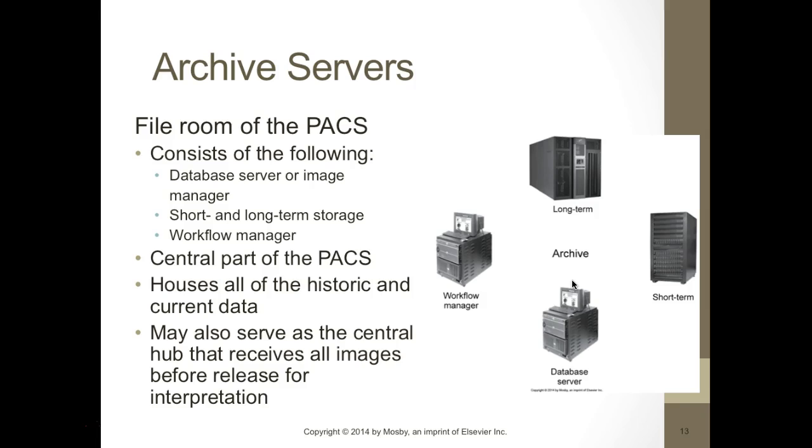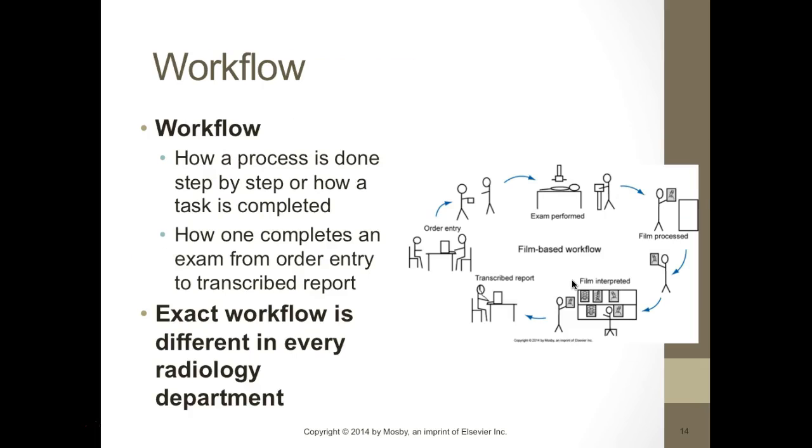It houses all the historic and the current data. So it may almost serve as the central hub that receives all images before they are released. So the workflow. Okay, so how does the workflow happen in radiology? It's how a process is done step by step, or how a task is completed. So how one completes an exam from order entry to transcribed report.